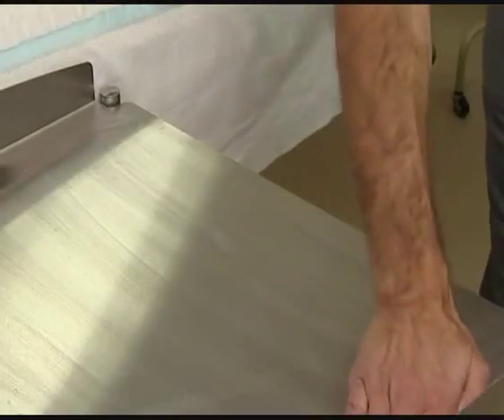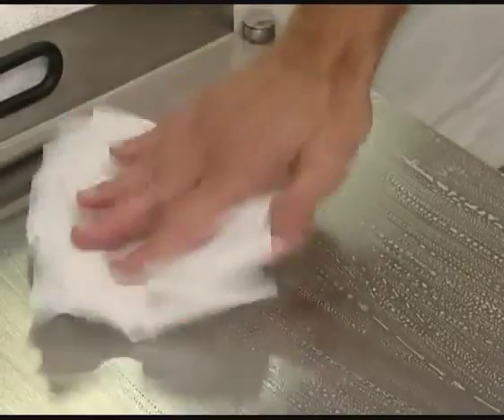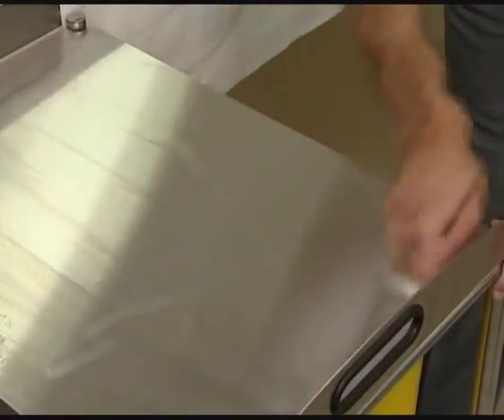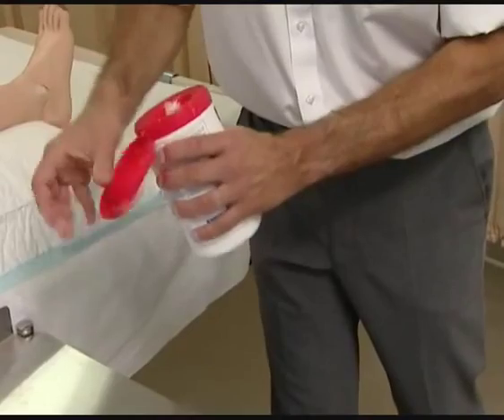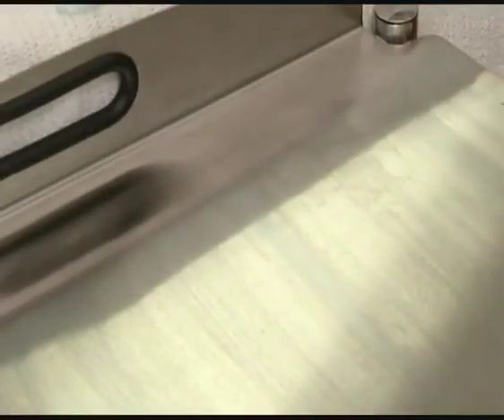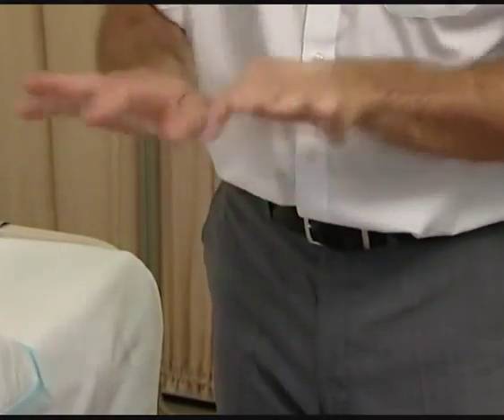If there has been any spillage of fluids onto the working surface, clean and dry the working surface with detergent and water and then disinfect the trolley. If there has been no spillage, disinfect the trolley with a 70% alcohol wipe. Having cleared away, wash your hands or use an alcohol gel.